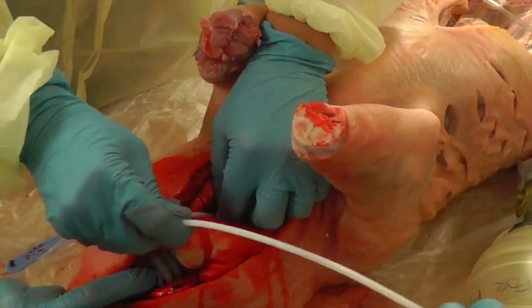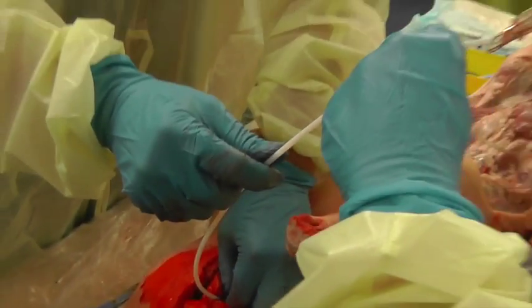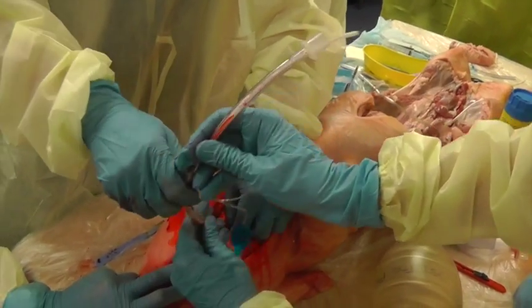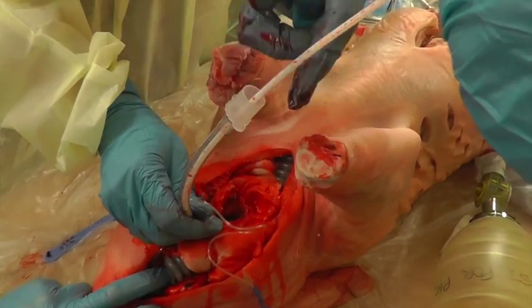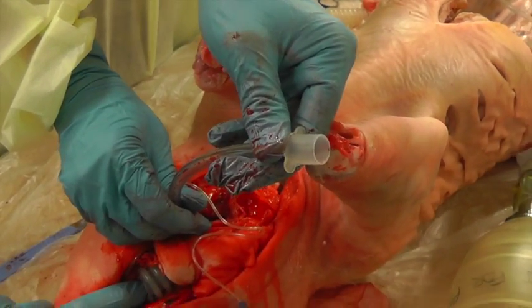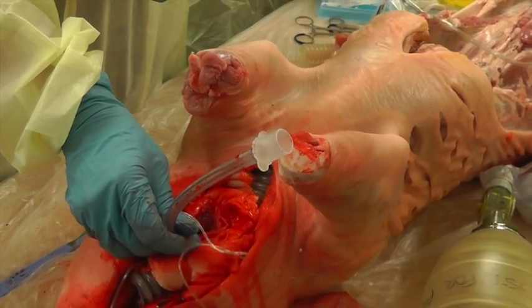I'm going a bit further — definitely in. I have the bougie. I have the tube. The tube's in. Take the bougie out. Connect it to end-tidal CO2 and a bag-valve mask piece.